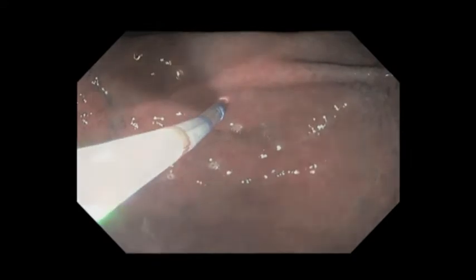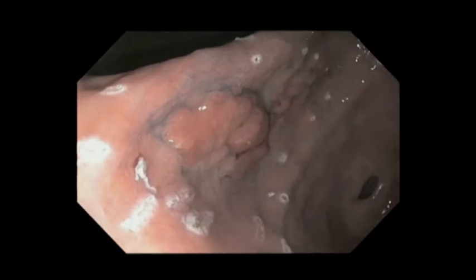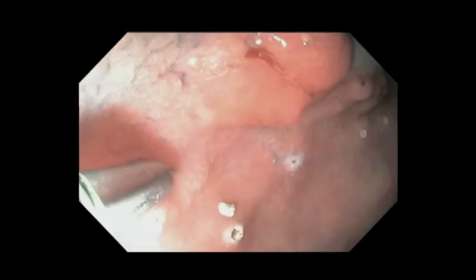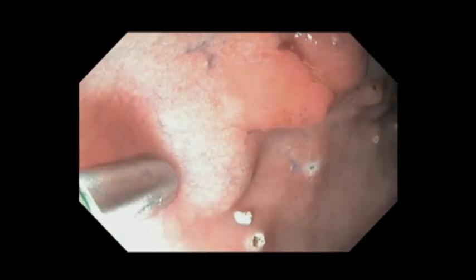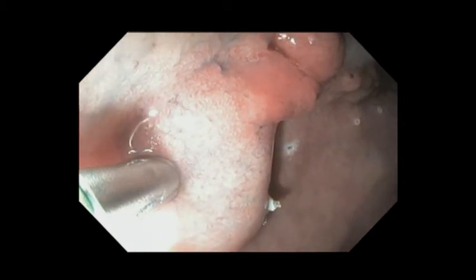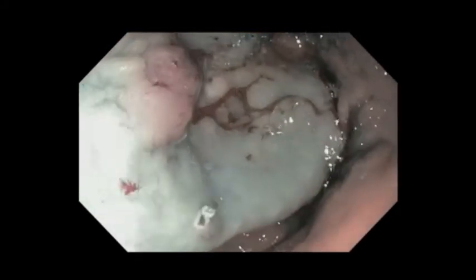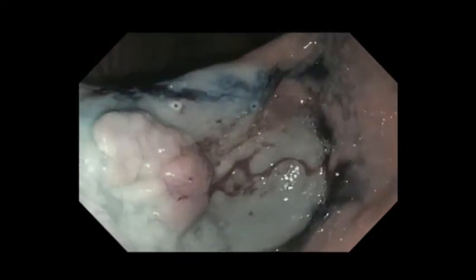To ensure we had a good margin for resection, we marked out a margin with electrocautery. We then proceeded with a submucosal lift, using a dilute solution of indigo carmine along with epinephrine injected into the submucosal plane. One of the essential things is to be in the right plane and to make sure that the lesion actually lifts off the muscle layer, which you can see happens nicely here.